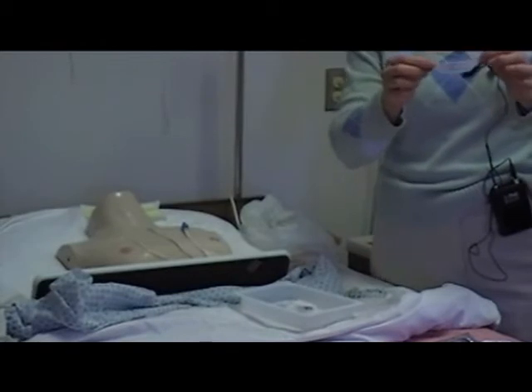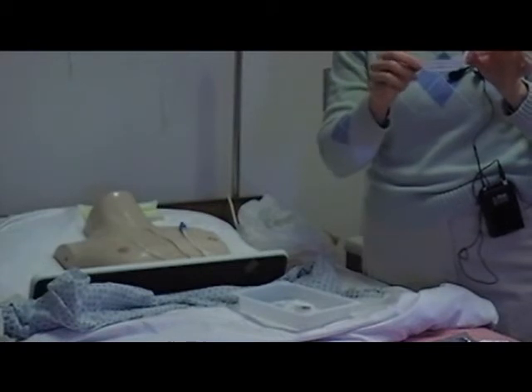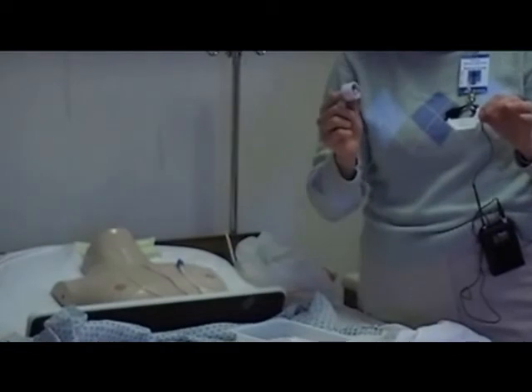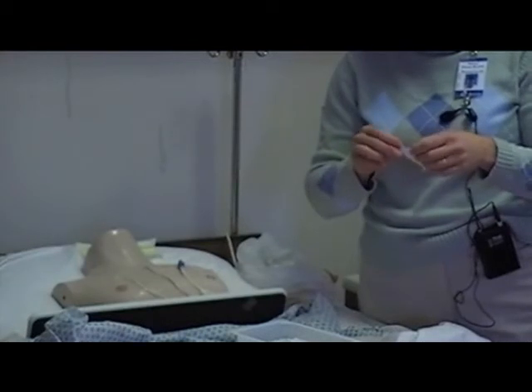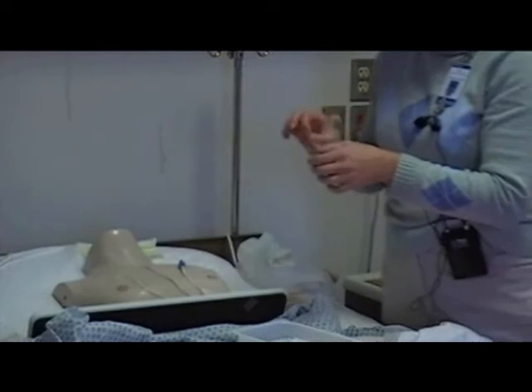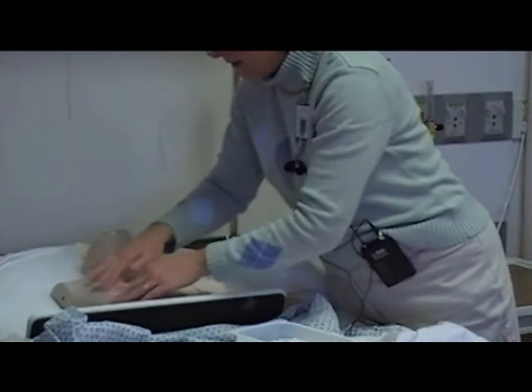I found this on that outer border of your transparent dressing. There's a little label on that. When you tear it off, you can write on that. Otherwise, once again, you've got your tape, and you can write on that. Never tear the tape off, put it on your patient, and write on their chest. They don't like it. So make sure that you write on something else and not on your patient. I'm going to put this on the dressing off to the side so it's readily seen.